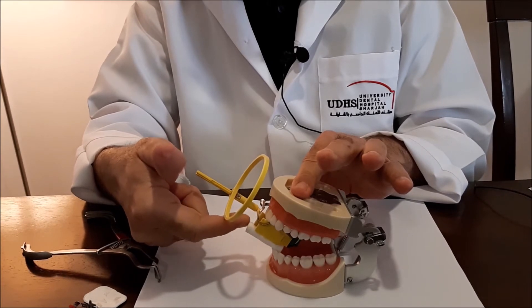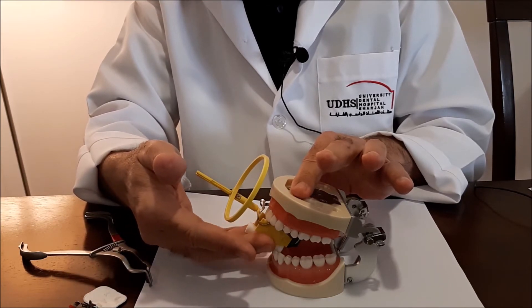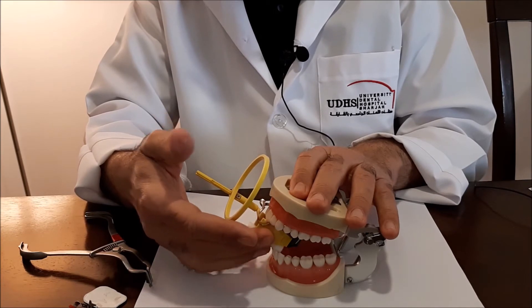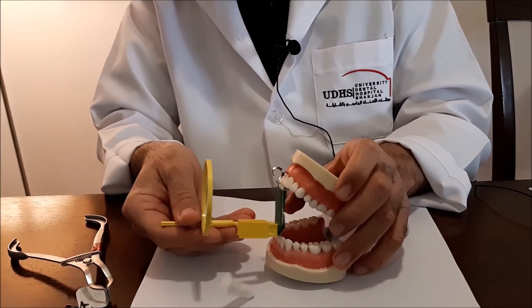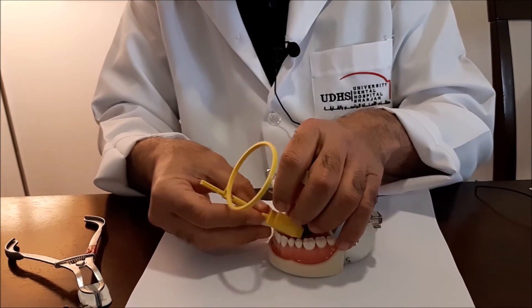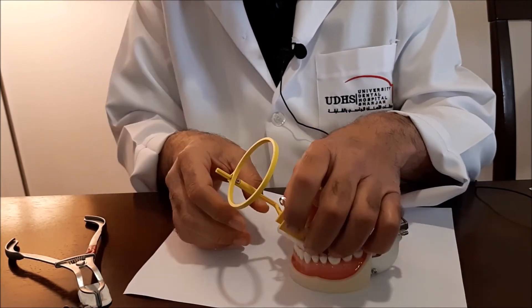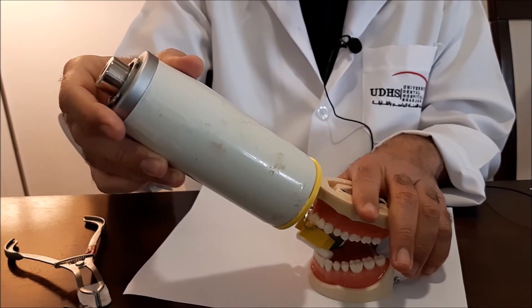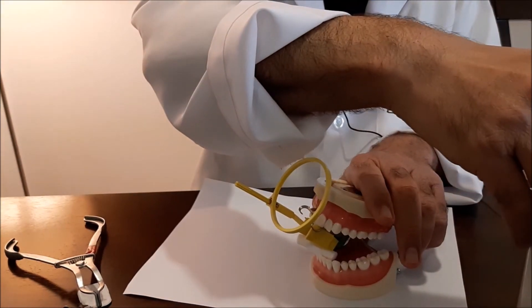The saliva present in the mouth makes the gadget slippery and it may slip and move. Using a cotton roll also improves patient comfort — the patient does not have to bite hard on the bite block but simply presses on the cotton roll, which is a more soothing action. Then direct your X-ray beam along the ring. All anterior teeth are managed in this manner.